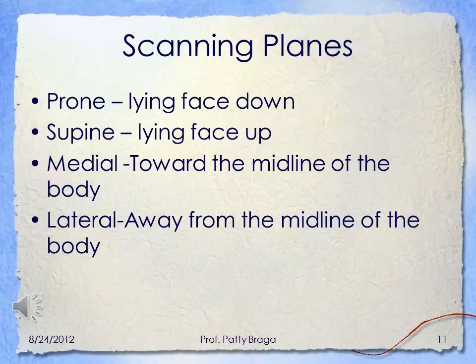The patient would be laying on their stomach. Very rarely do we scan in a prone position. Most of the time we're scanning in a supine position, where the patient is laying face up or on their back. Medial just means towards the midline of the body. Lateral means away from the midline of the body. But you need to understand those terminologies.